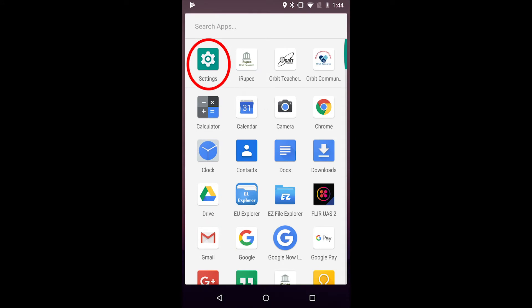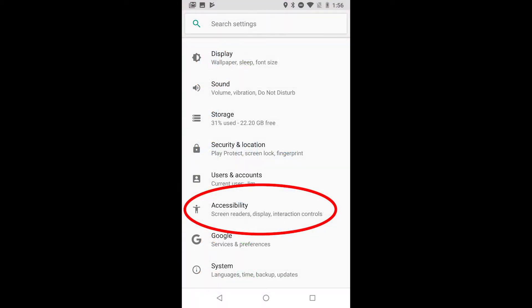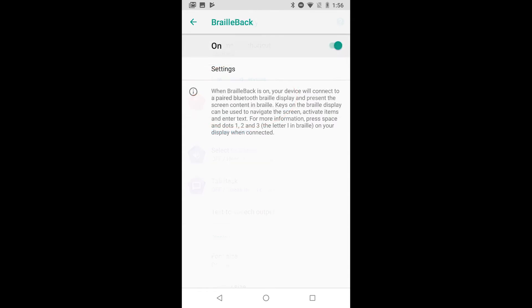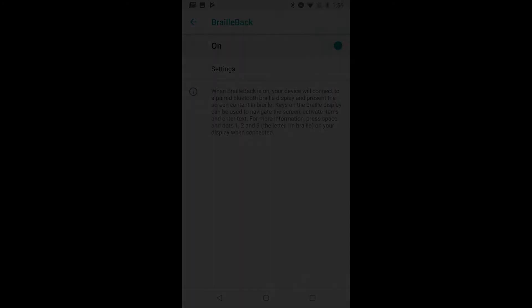Now go to the settings of your Android, then Accessibility, and then BrailleBack. Now turn on BrailleBack. The Orbit Reader 20 will now connect to the BrailleBack.